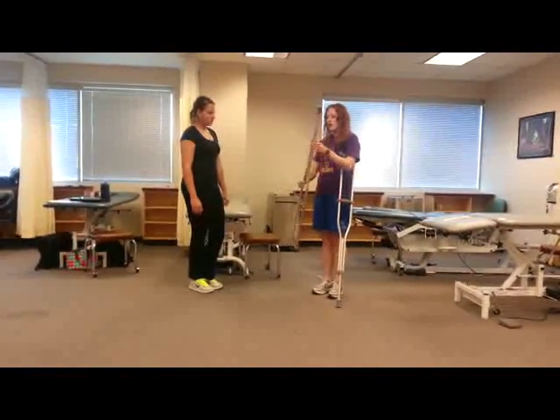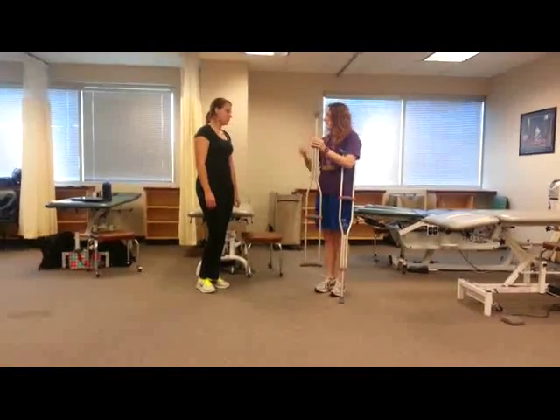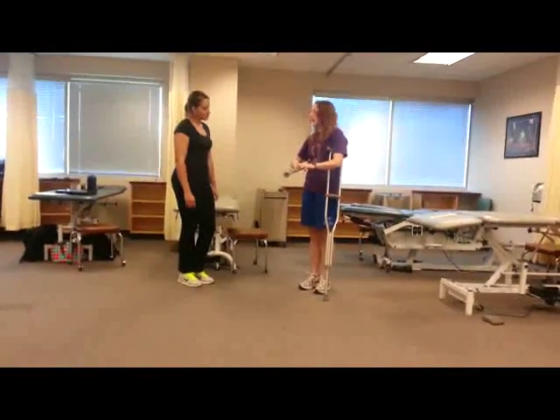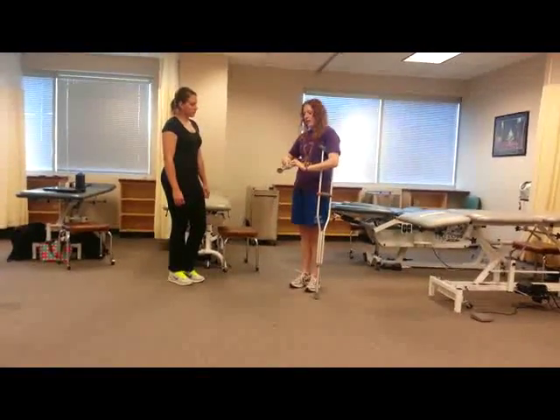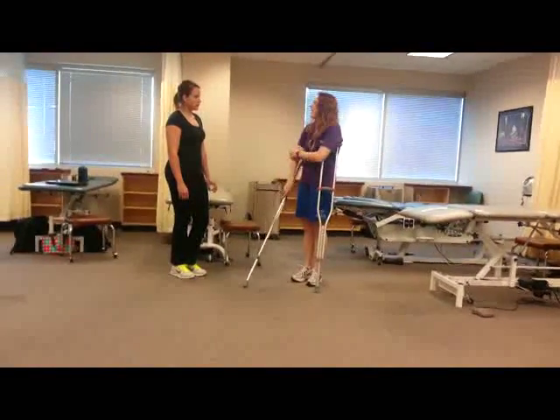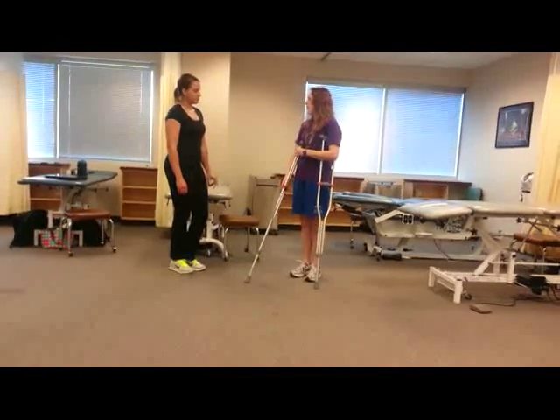The way that you would change the height is very simple — there's just a button here. You push it in and this will adjust up and down. Also, on a lot of these newer crutches, you'll actually have a height marker here. So if you want to, you can ask your patient beforehand how tall they are, and that will give you at least a good starting point for how you want to adjust the crutches.